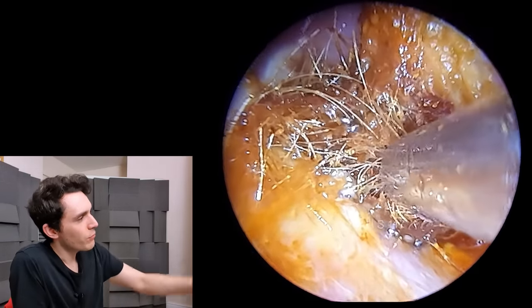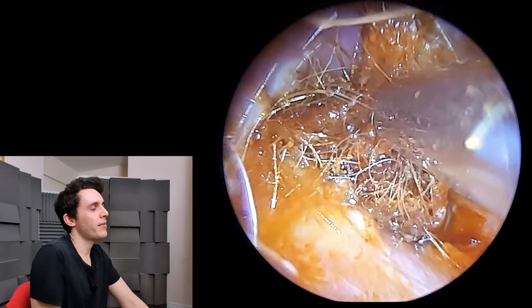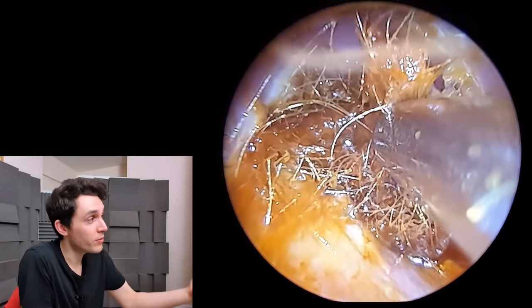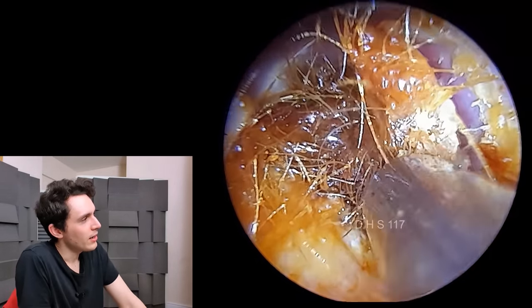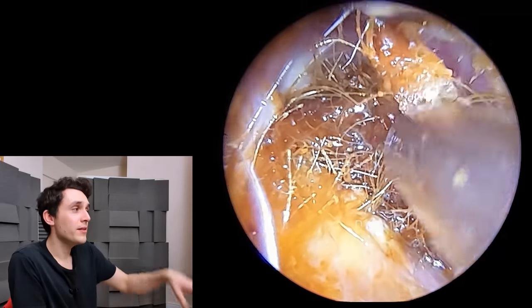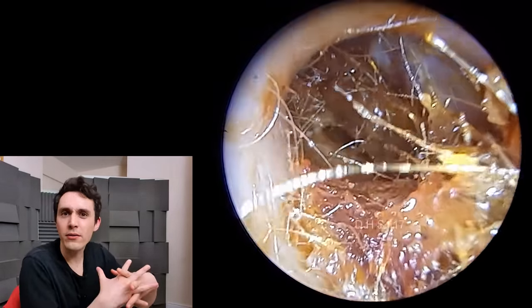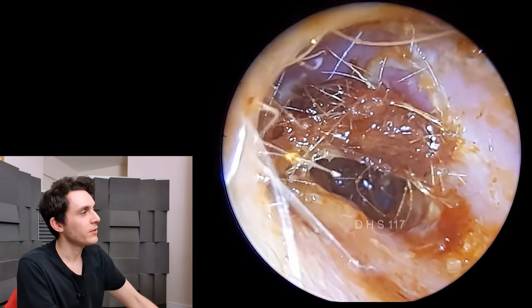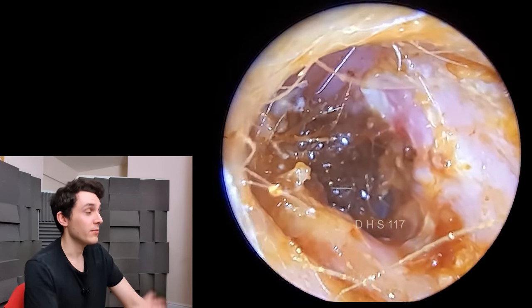So now what we're doing here — see this kind of core as I'm manipulating it — this is where the patient started to get a little uncomfortable. Up until now the procedure has been fine with no pain, but he's finding this a little bit uncomfortable, shall we say. I'm just trying to get this final boulder out here. Normally these hairball cases are actually really difficult because the hair acts like wire in concrete, giving the whole structure a lot of strength and resilience. This is quite a good example — it's actually quite an easy case.